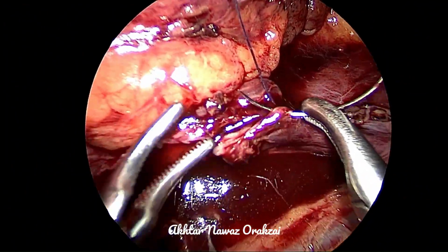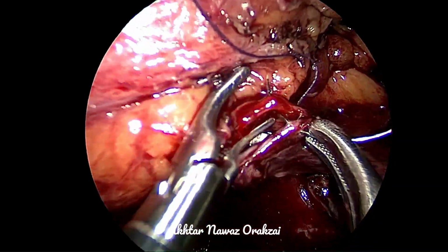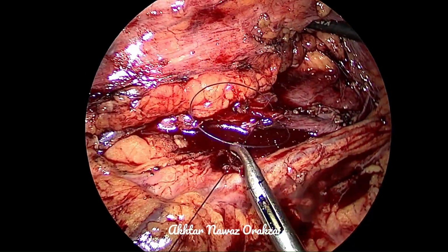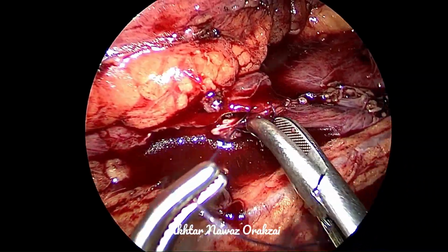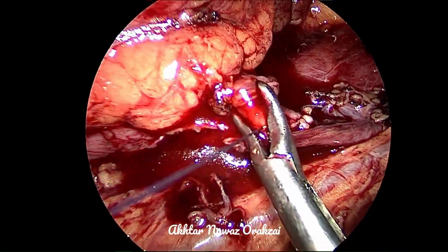Once we are past that point, the anastomosis becomes easier and easier. However, believe me, the removal of the stones in this case were not really easy, and it really tired us.